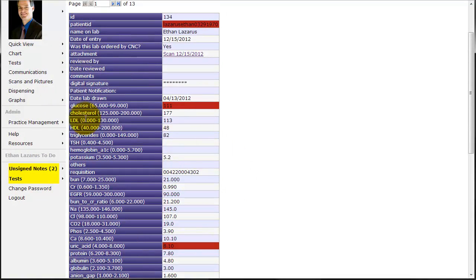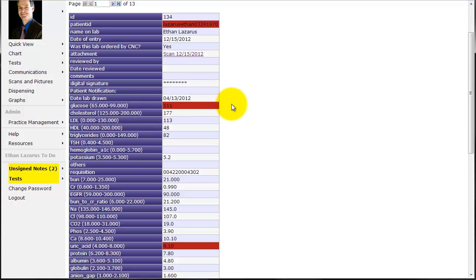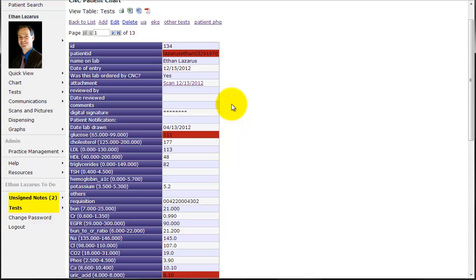It also went ahead and it gives me a normal range. And we just have it right now pulling Quest normals for men and women. At this point I have not made it pull normals by age. It's important to note that these normals might not apply to children or to the elderly. But these are going to be typical normal ranges for most patients. And we've also programmed the chart to highlight anything not in the normal range to make it easy to pick out any potential problems.